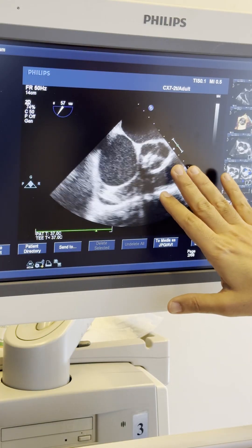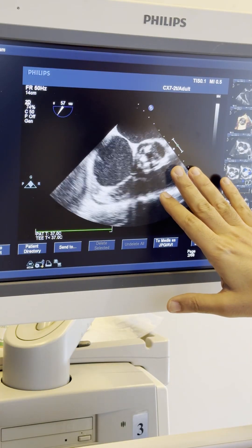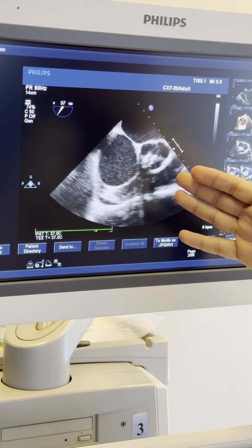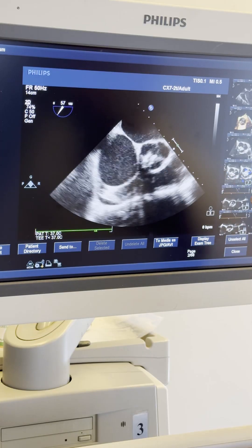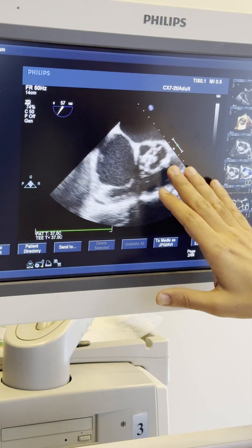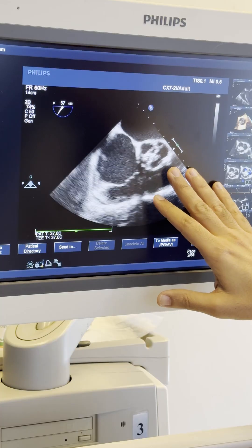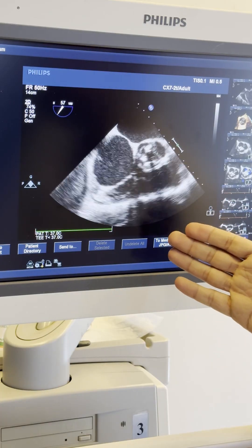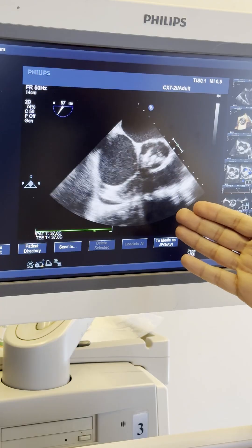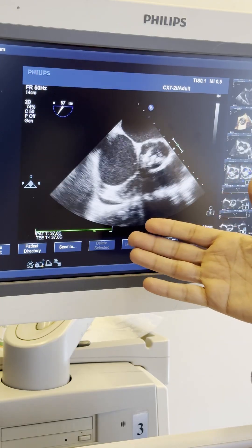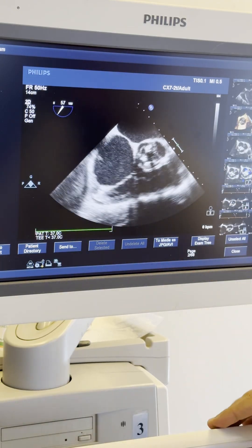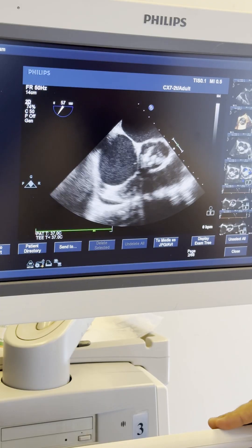This patient, as you can see from the 2D images on transoesophageal echo, had calcific aortic valve disease. His gradient was high but there was also significant aortic regurgitation. Because he had renal impairment, he was referred for transoesophageal three-dimensional echocardiography to analyze the aortic root and give all the dimensions for the TAVI procedure.